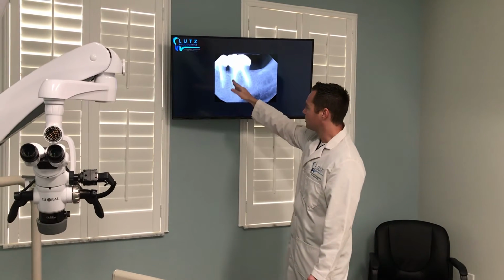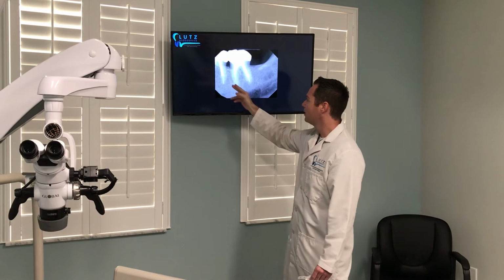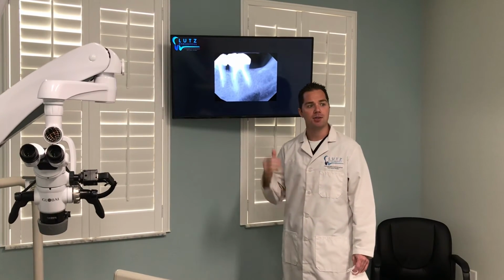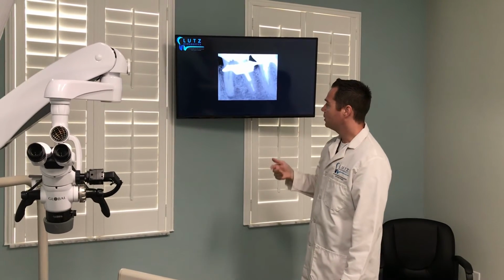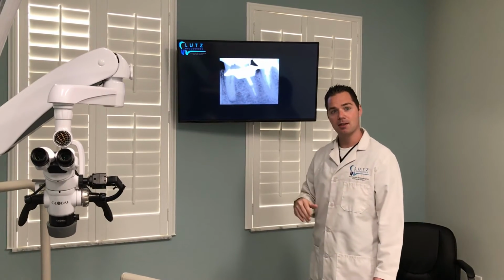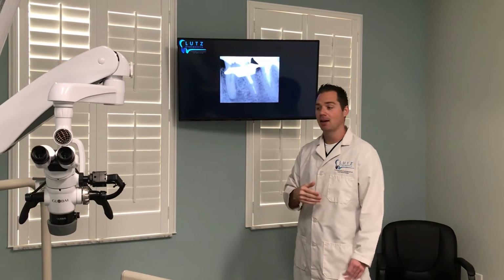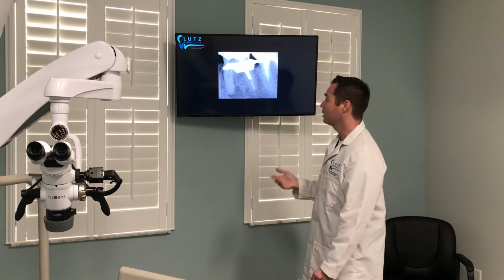This is just a picture that we took of 18 to show that the periodontal ligament space is pretty much uniform all the way throughout, that there is not an infection associated with that tooth. Next slide. So we initiated the case. We were able to successfully take out the obturation material and then place the calcium hydroxide, let it wait for about 2 weeks, had the patient come back, resolution of symptoms occurred, patient was happy, everything went uneventful.